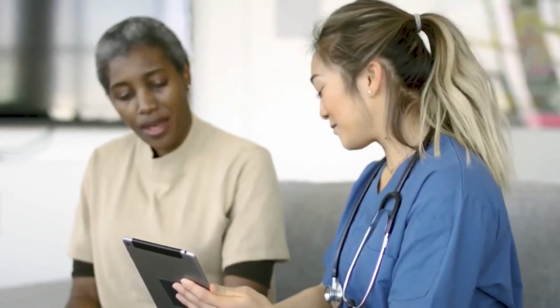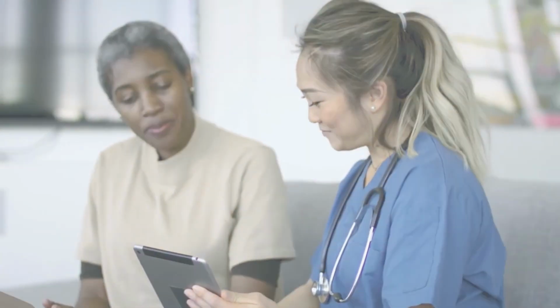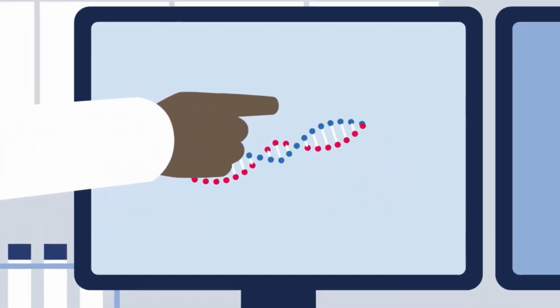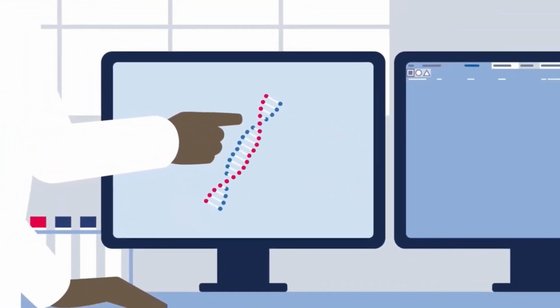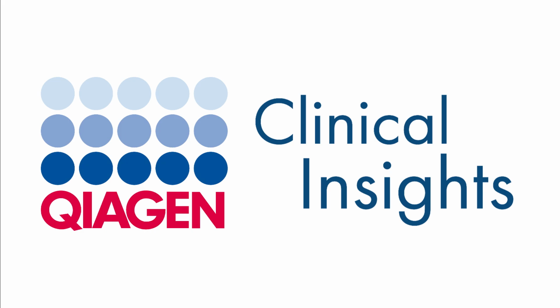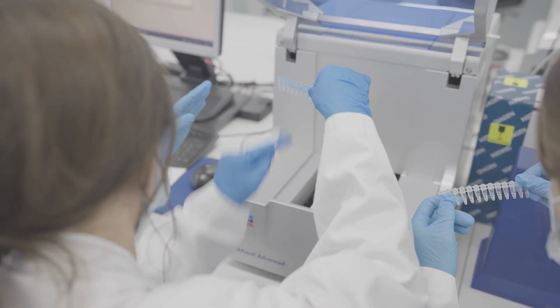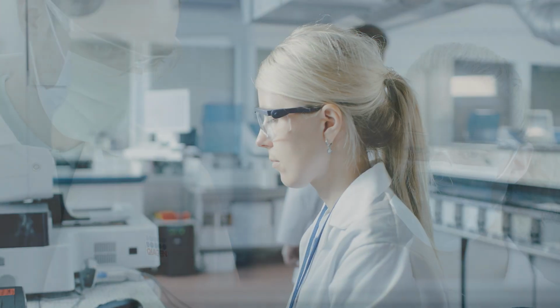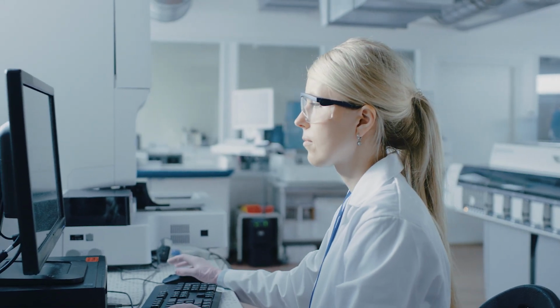Although NGS-based cancer testing has become increasingly accessible, staying current with the constantly evolving research and knowledge in the somatic field remains challenging. Hi, Caitlin here again, and welcome to part 2 of our database informational video series. In this video, we'll illustrate how HSMD can help address the most common challenges and save valuable time in designing accurate and comprehensive somatic variant panels.